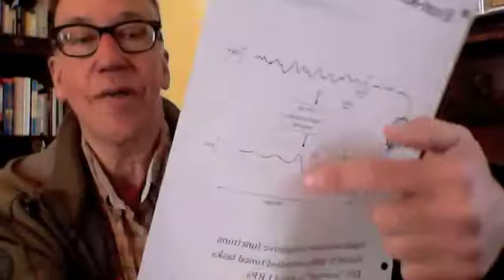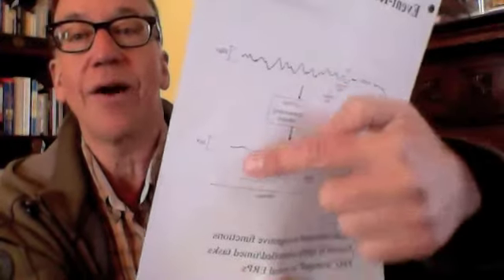And you can do all sorts of interesting things. For example, if you did that same sound, but then all of a sudden you changed it, you would see on those trials a new waveform out here that has a more frontal focus, which involves part of your response to the novelty of a different stimulus.